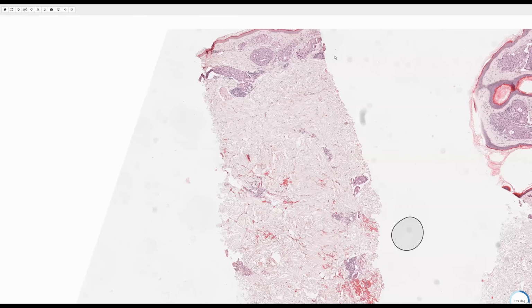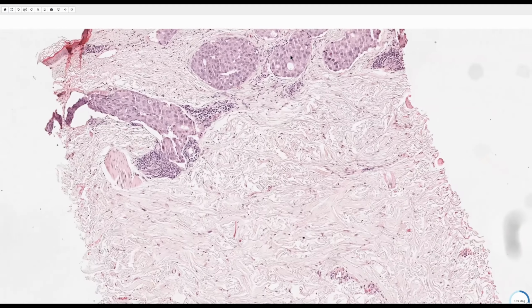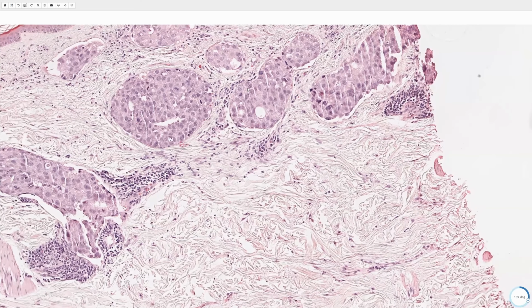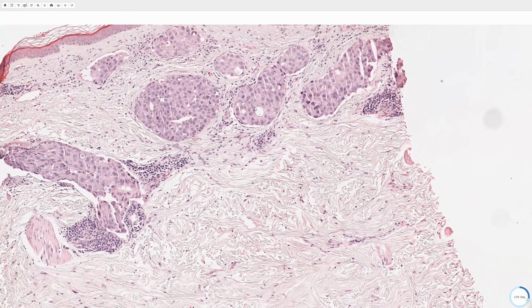Now, if you had a dermal tumor with glandular differentiation and you weren't sure if perhaps this was eccrine or a primary epidermal or primary adnexal tumor, which sometimes you can also see on the chest, then a P63 or P40 can be helpful. P63 and P40 are both positive in primary epidermal derived tumors and should be negative in breast cancer or other metastatic lesions. And a cytokeratin 5/6 is helpful.